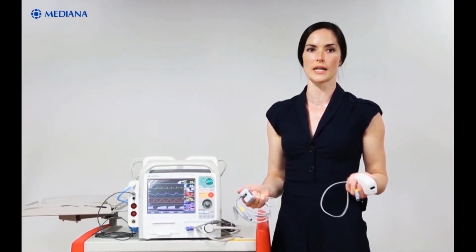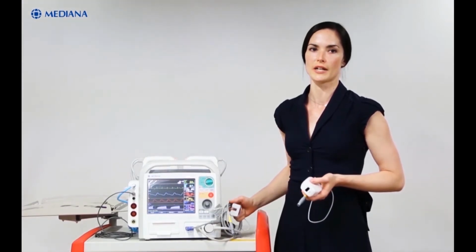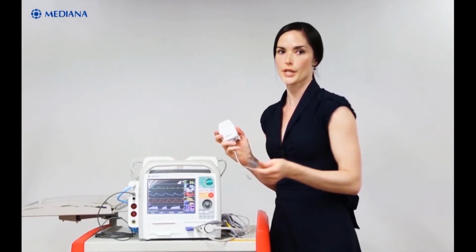For EtCO2 measurement, you can use a genuine Respironics CO2 sensor and then connect mainstream or side stream sensor to the CO2 connector on D500's side option case.